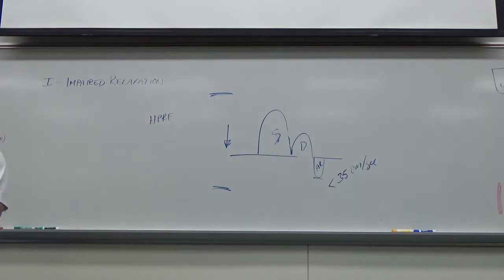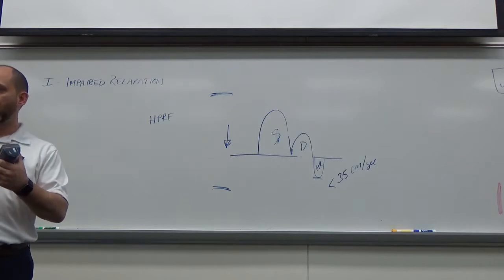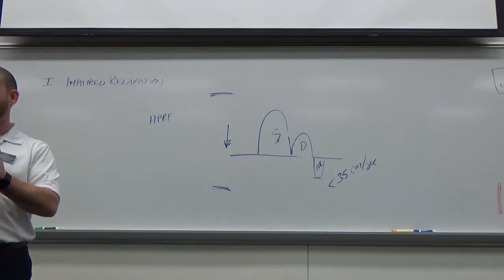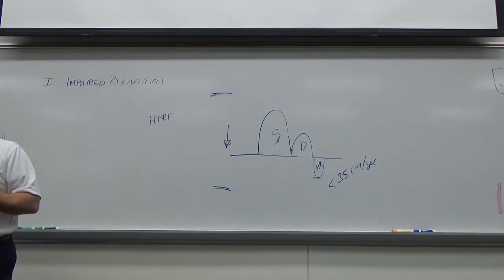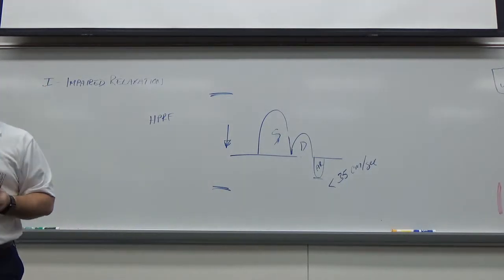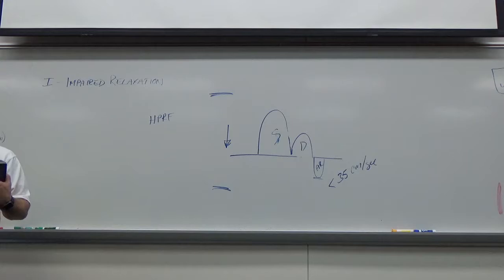And what does that mean? It's high pulse repetition frequency. Why does the system do it? It's taking multiple gates. Once that pulse repetition frequency has exceeded its limit, it adds another gate at a different level. The pitfall to that is that you're sampling two different things at the same time, so you've got to be careful. The reason it does it in pulsed wave is because in vascular, you don't have the option to use continuous wave Doppler, unless you use a pencil probe. In echo, we do use continuous wave Doppler, so in echo, you basically never want high PRF.